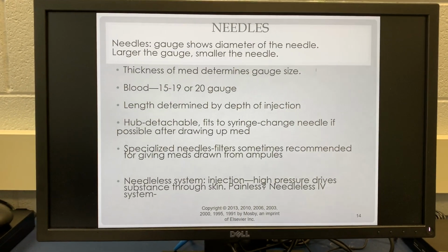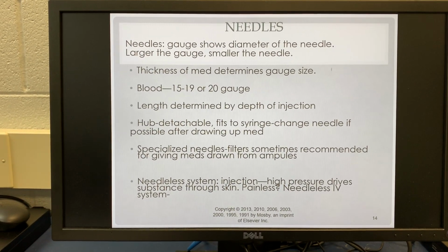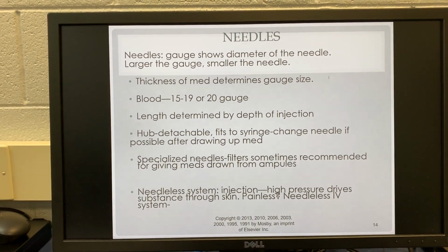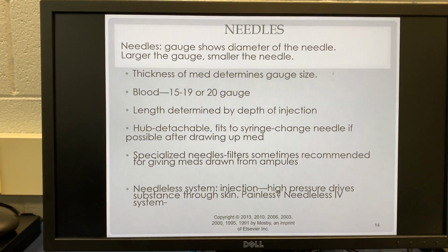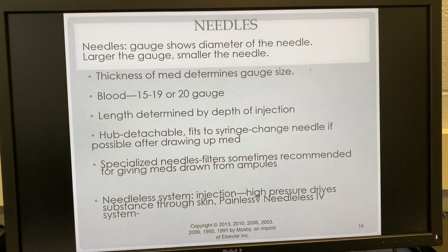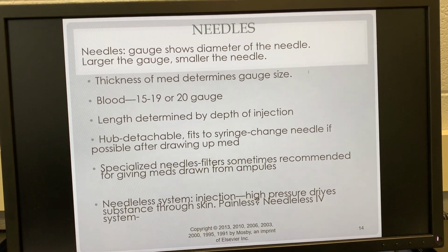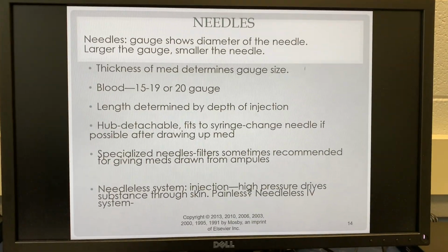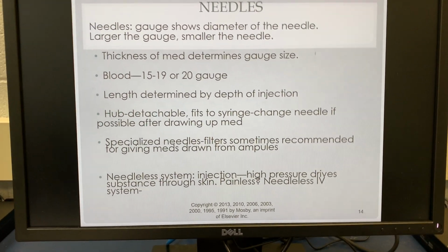There are different kinds of needleless systems. Sometimes there are like high pressure setups to drive a substance through the skin. It's not painless, give me a needle any day. But on page 44, you see an example of some needleless IV systems where it cuts down on the risk of getting stuck because you've got certain syringes that just fit into the rubber port. However, you have to make sure all the equipment comes from the same company because one company's needle won't fit into another company's port.